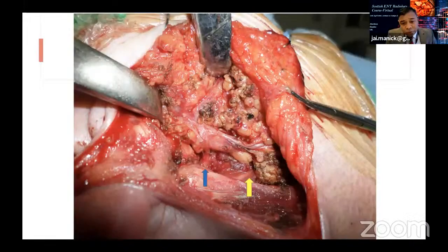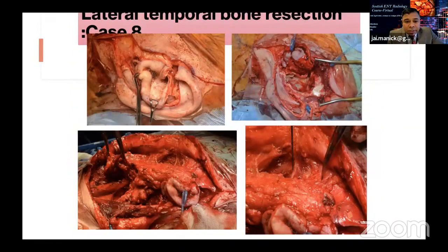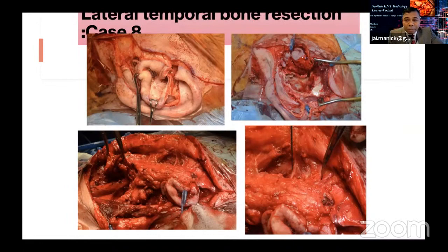But what you see really is the character of the lump, the margins, the neck nodes, and the involvement of the superficial and deep lobes. These are the main features you can see in the parotid area. See, for example, this is external ear canal cancer. It may look small, but remember the ear canal is related to the parotid and the mastoid and the brain on the top, and the lower part is the neck nodes. So you need to have a lot of information before embarking on a major operation.